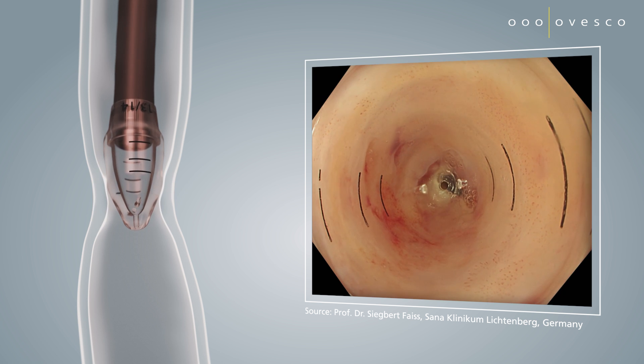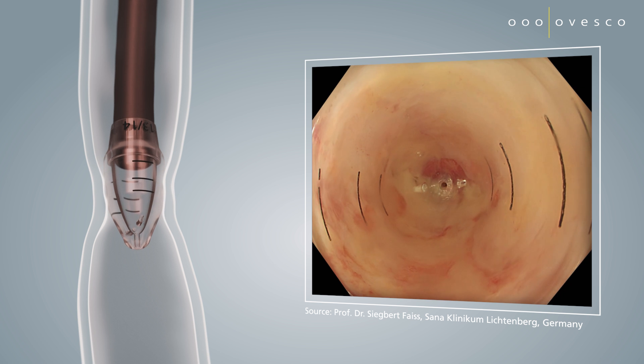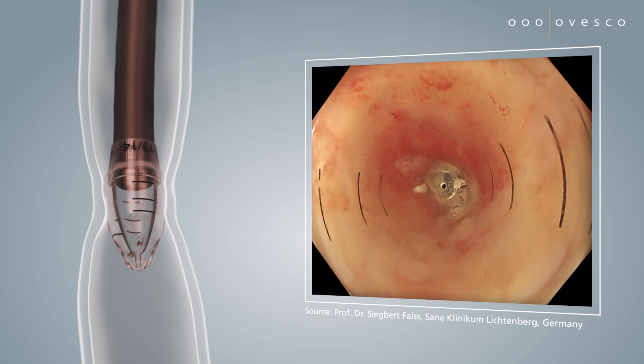The transparency of the bougie cap enables immediate optical control during bougienage. The generated tissue tension becomes visible immediately, allowing for better avoidance of overstretching.